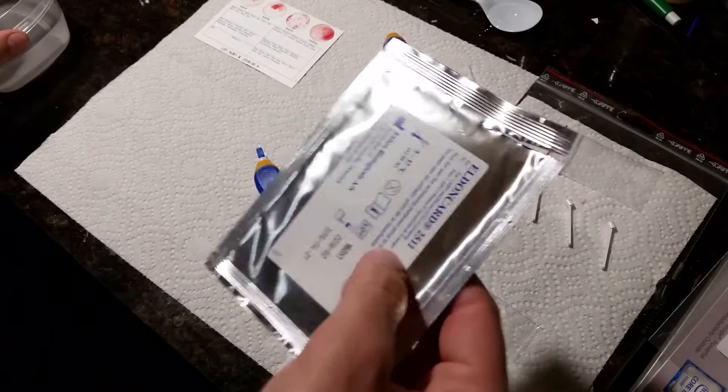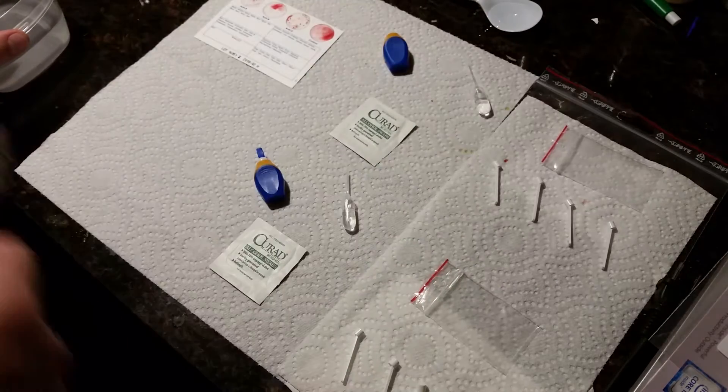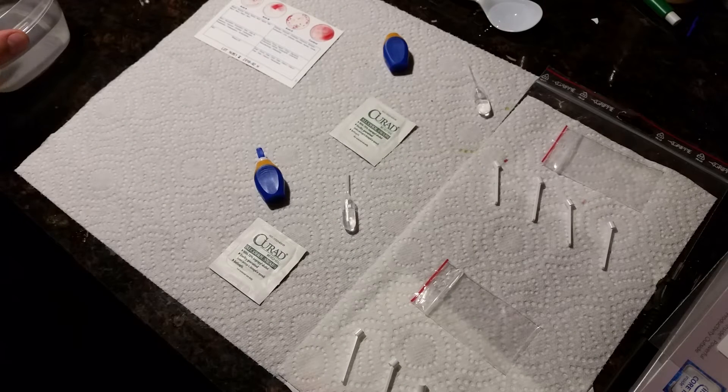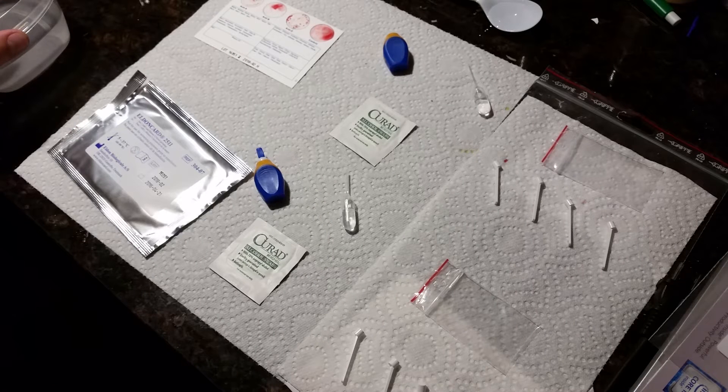I recommend you buy two or three of these kits. I bought three — I'm using two right now, and then in a couple of days I'm going to do the third one just to see if anything was different.